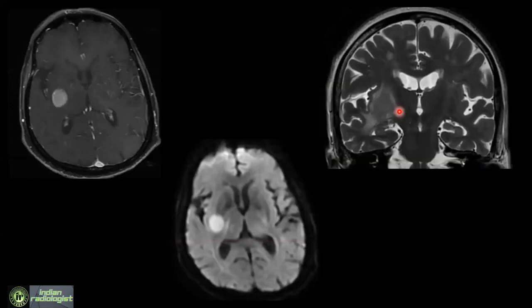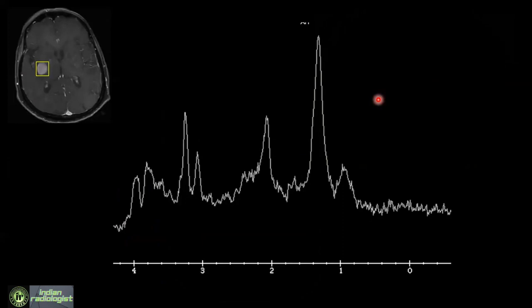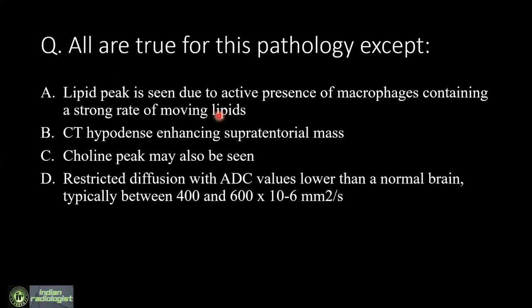Another set of images: post-contrast axial T1, diffusion, and coronal T2, showing a lesion with homogeneous enhancement, restricted diffusion, and T2 hypointensity. Single-voxel spectroscopy was also obtained for this patient. The question asks: all are true for this pathology except — the options include lipid peak due to macrophages containing lipid, CT hypodense enhancing supratentorial mass, choline peak may be seen, and restricted diffusion is characteristic.